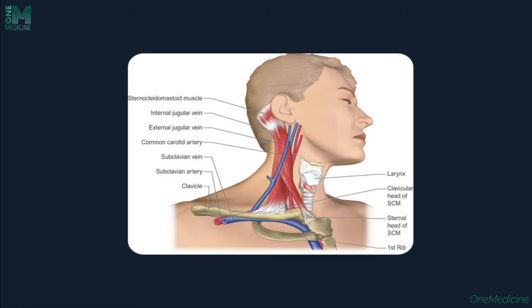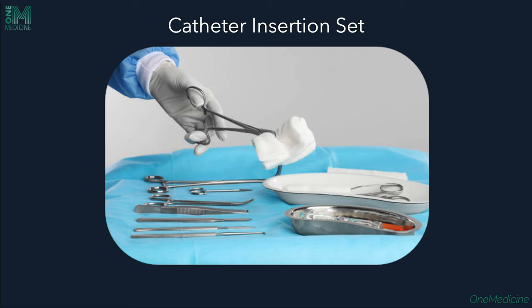Carefully observe for the carotid pulsations and have an idea about the probable surface anatomy of the jugular vein and carotid artery. After wearing sterile gloves, open the sterile dialysis catheter insertion set usually provided in the ICU. This consists of a sterile cup, forceps, kidney tray, cotton rolls, and sterile gauze and pads.